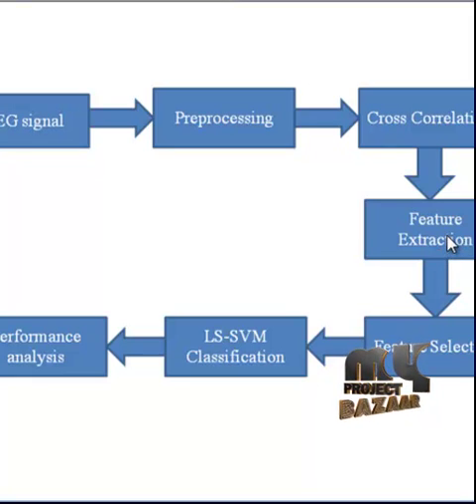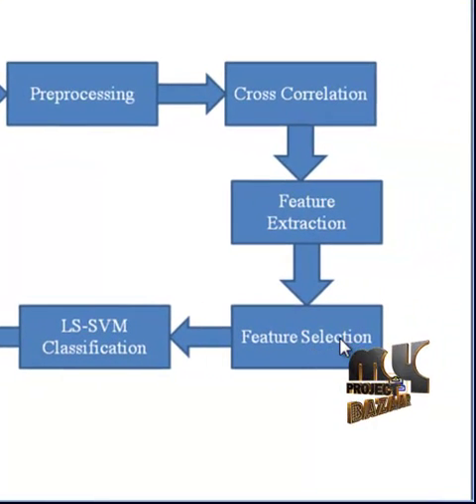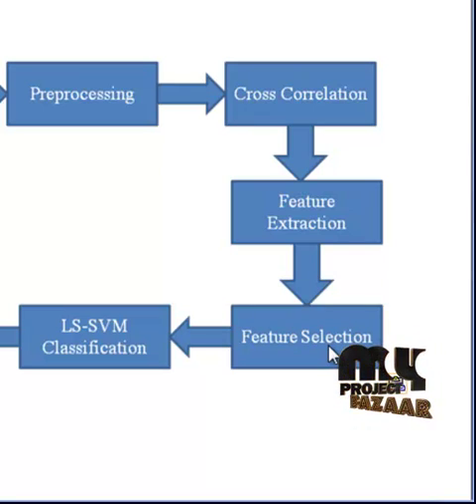Similarly, the database containing several signals is trained based on the features extracted from them. Then the extracted features are selected. We select a number of features from the originally extracted features using a genetic algorithm. The features that are not always repeated and the features that have high-value data are said to be the best features. The best features are selected using the genetic algorithm from both the training and the testing features, and they are saved.